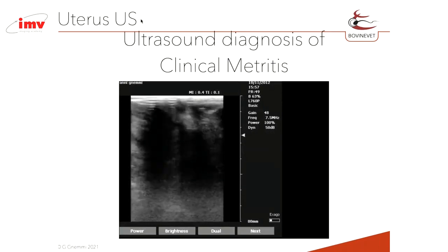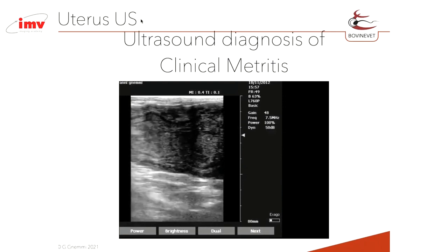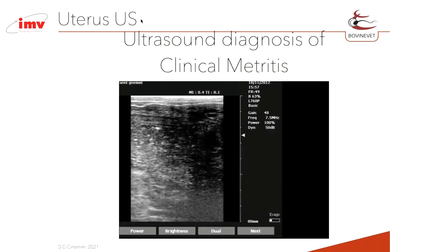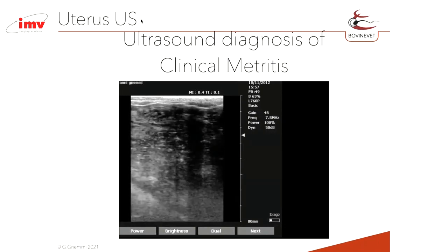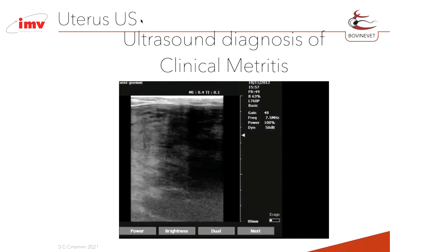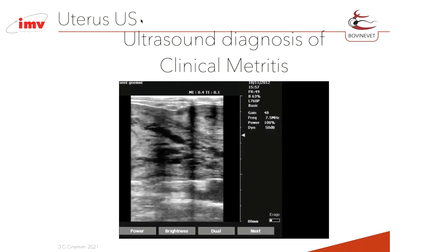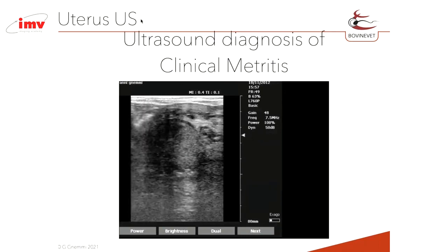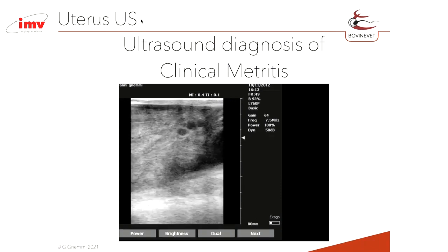And well, this is normal, it is the epithelium that is in necrosis. You have to remember that the macroscopic involution of the uterus requires between 4 and 5 weeks, but the microscopic involution, so the regeneration of the epithelium of the endometrium, requires between 6 and 8 weeks. So during the first 10 to 15 days, if we check the uterus, we can see a typical white line over the cotyledons. This is the epithelium that is in necrosis, and under this there is the regeneration.